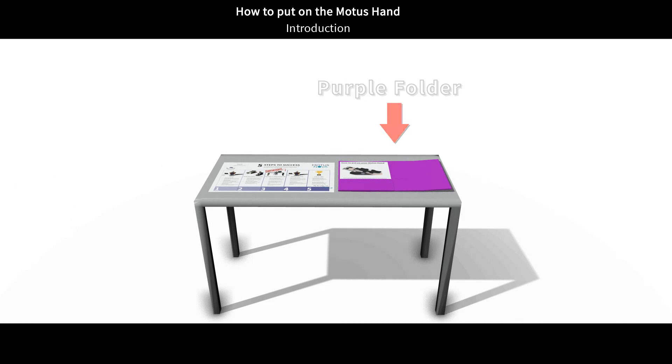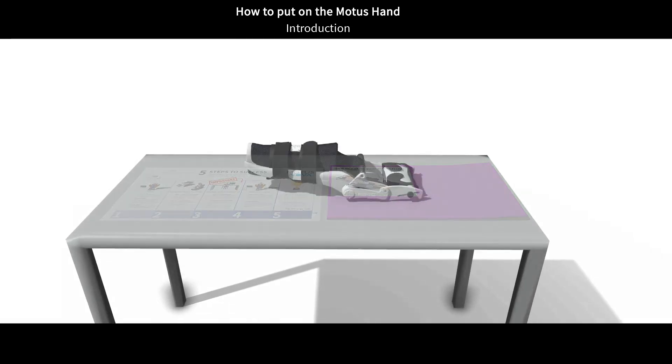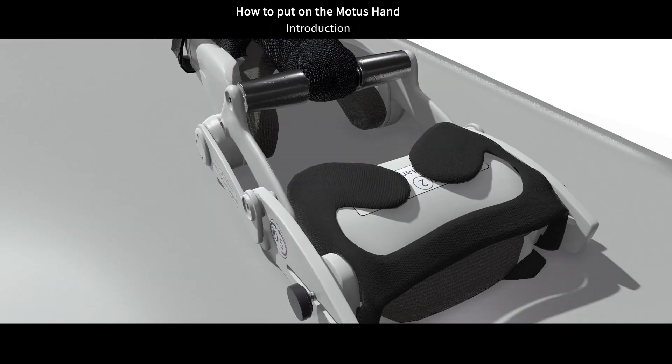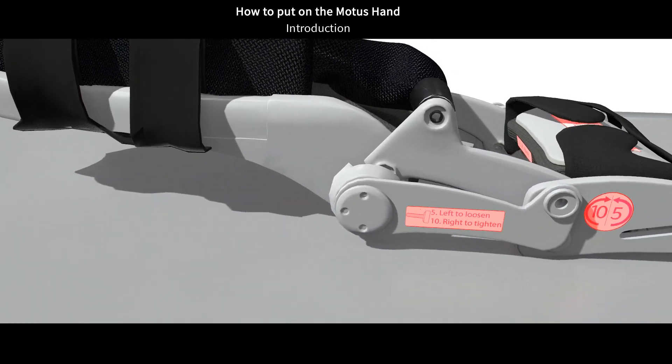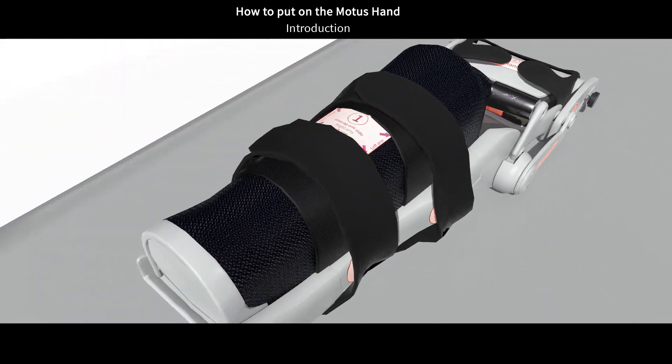Putting on the Modus hand can be challenging the first few times you do it. But as you practice and improve, I am sure you will find it gets easier over time. To help make putting on the controller easier, we have placed stickers on the Modus hand. The stickers are there to help guide you through the steps, and I will be referring to them as we go.